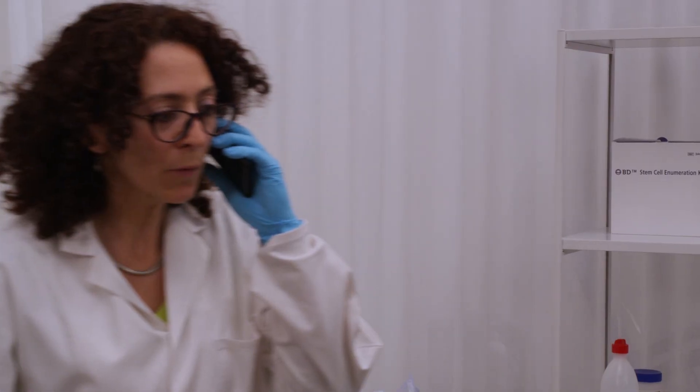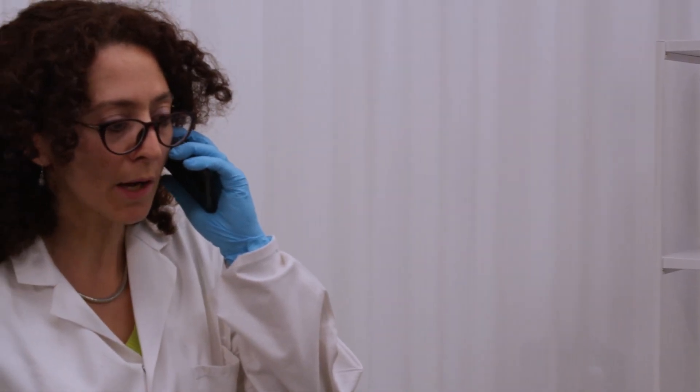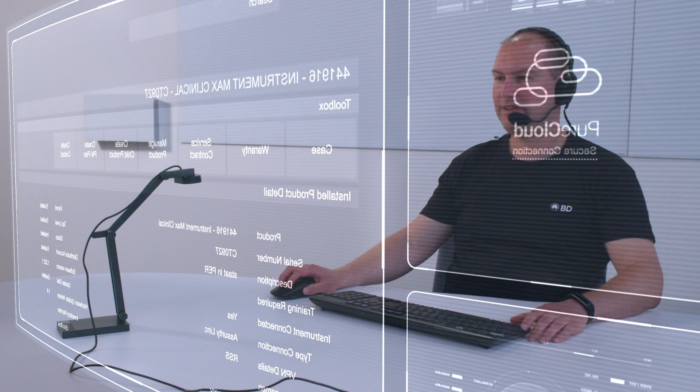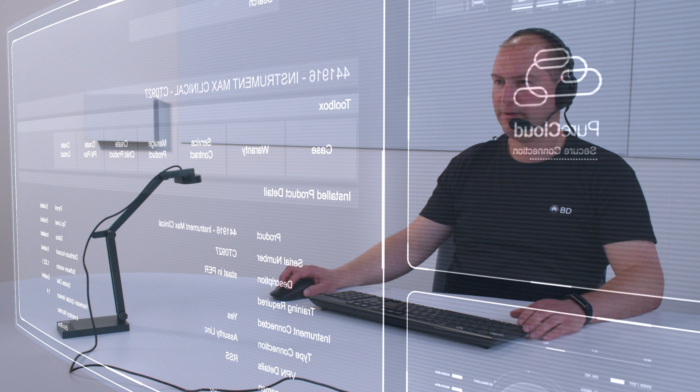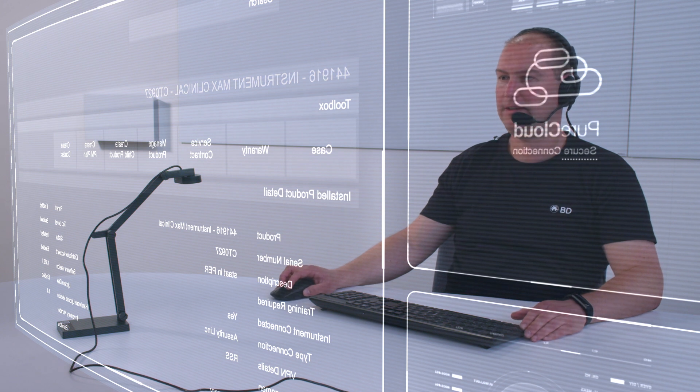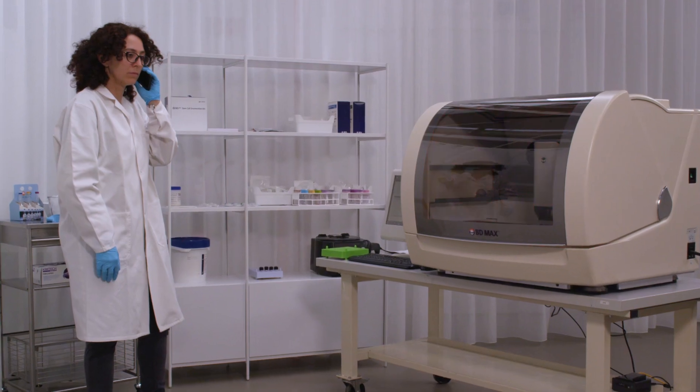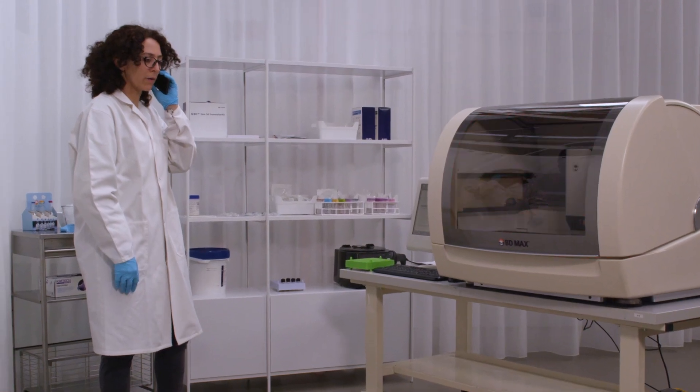I have a problem with my BD Max. It seems that my cartridge is stuck and the drawers are not opening. Okay, I can see that the serial number of your instrument is CT0927. Is that correct? That's correct.